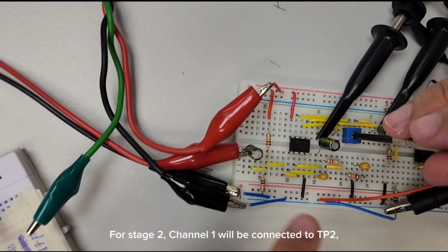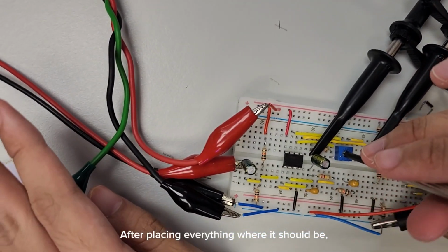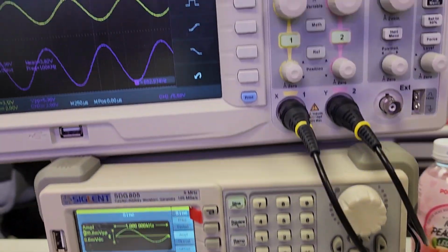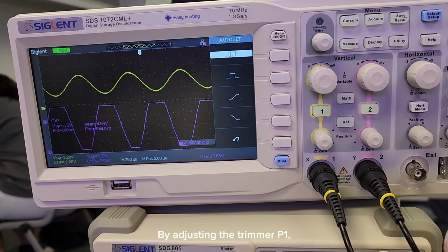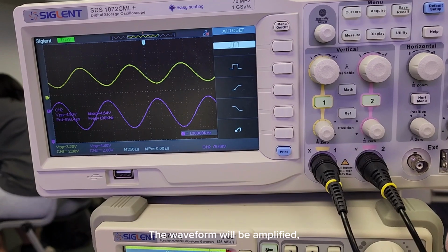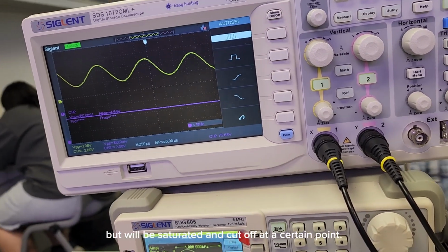For stage 2, channel 1 will be connected to TP2. The frequency and power supply will remain the same, and then connect channel 2 to TP3. After placing everything where it should be, the output voltage will be around 5.44 volts. By adjusting trimmer P1, the output waveform will change. The waveform will be amplified, but will be saturated and cut off at a certain point.